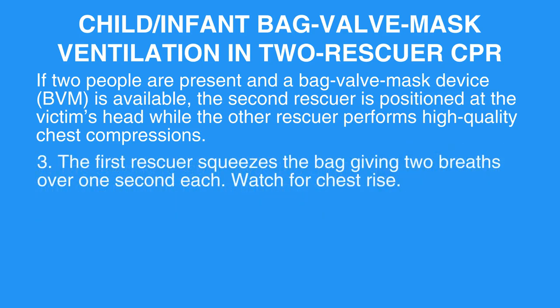Step 3: The first rescuer squeezes the bag, giving two breaths over one second each. Watch for chest rise.